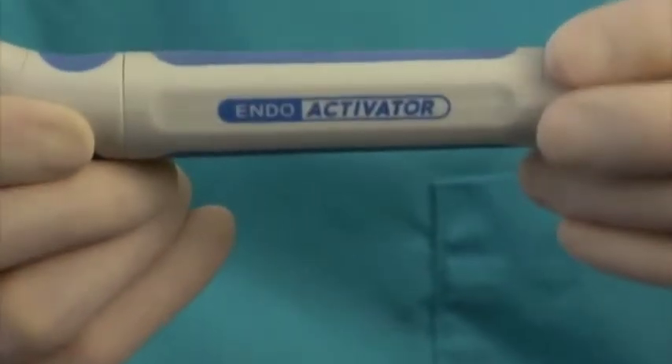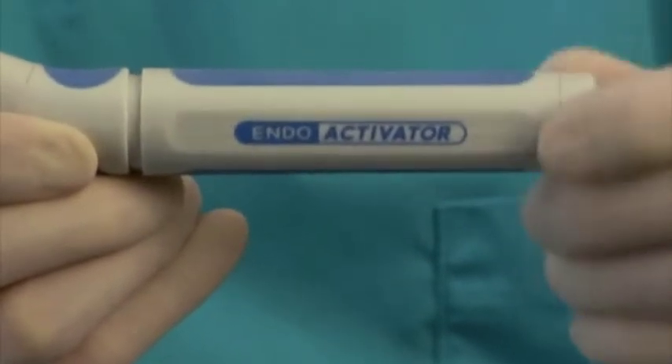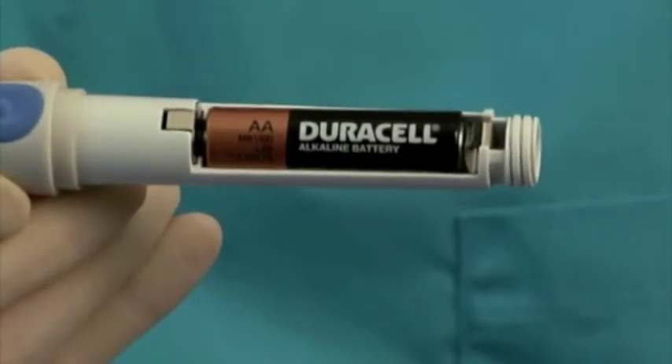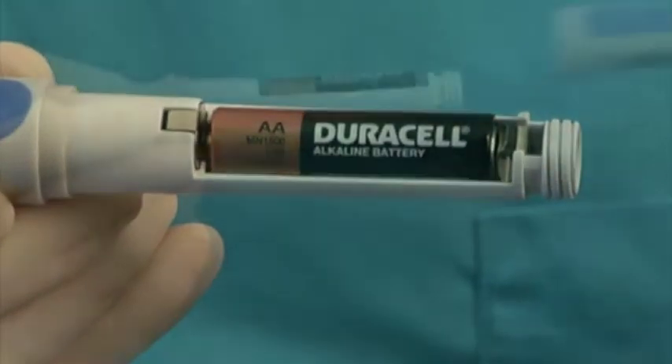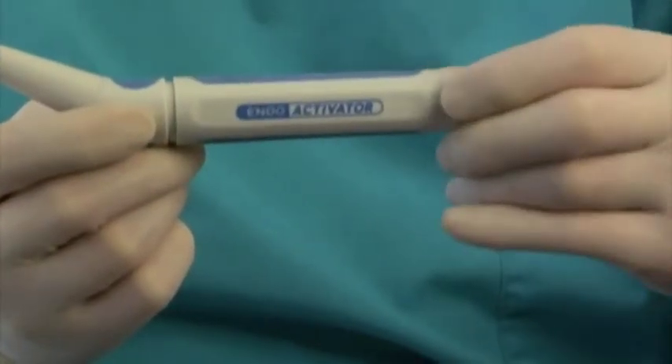To access the battery compartment, simply turn the non-removable screw cap counterclockwise to remove the housing. Remove the battery and replace with a premium-quality AA alkaline or lithium battery. Depending on use, periodically install a new, fully charged battery to ensure optimal performance.